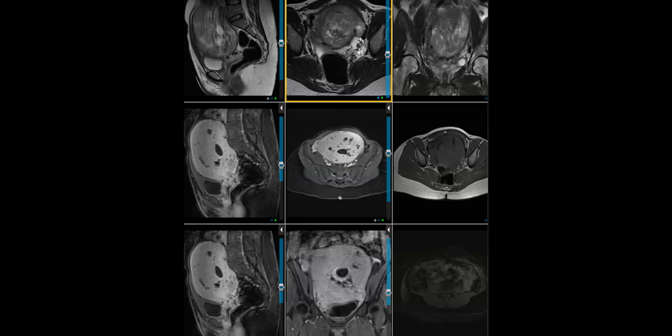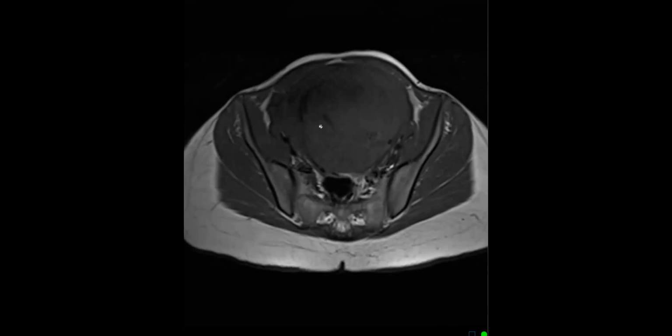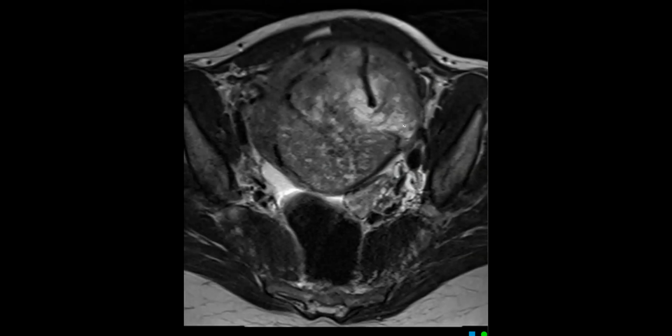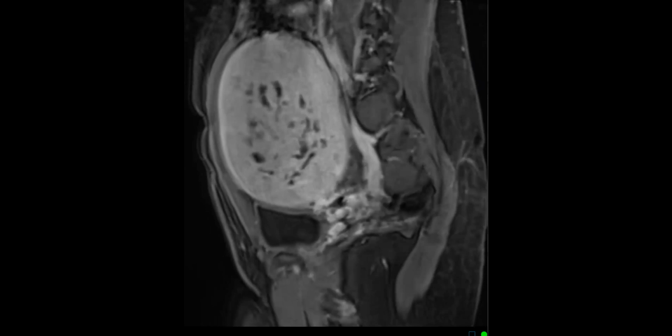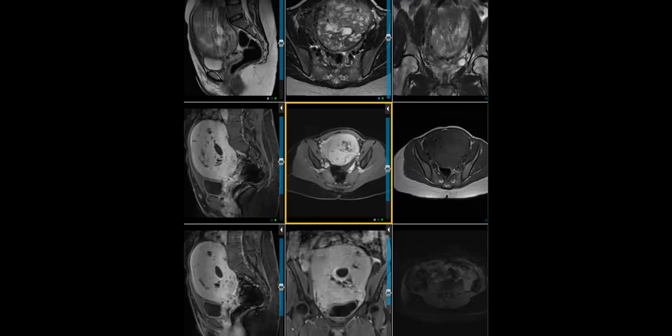Swachchhanda, I have a quick question. Can you show the T1 pre? I just want to see if there's any hemorrhage in it. Sure. Oh yeah, so this is the T1 pre. There's nothing significant, no T1 brightness. Little bit here. And if we look at the margin, the margin is pretty smooth, except there's a little bit of bulge in this area, left lower. Post contrast, obviously we see this is mostly intensely enhancing with multiple areas of non-enhancing area, which is not unexpected in a large lesion. Apart from that, there is no extra-uterine extension, no gross extension. There is no hydronephrosis. And we didn't do diffusion, but I don't think that would be super helpful again.